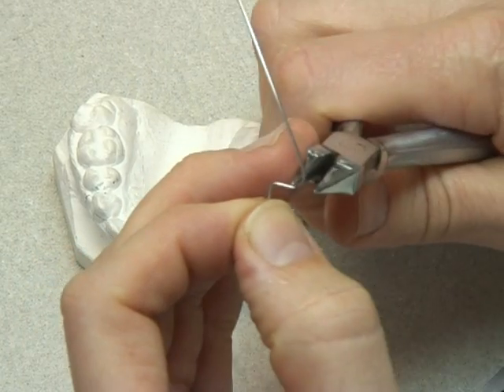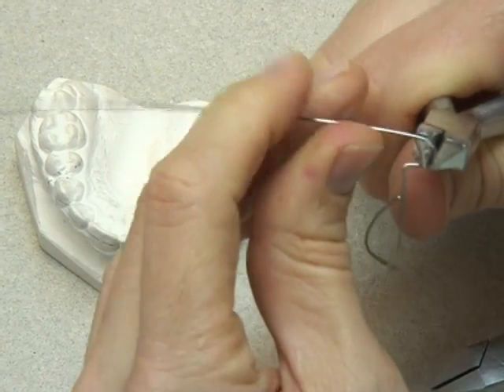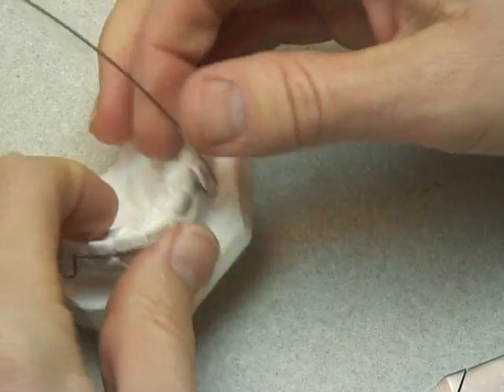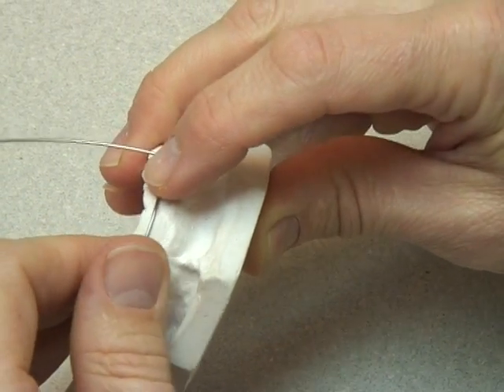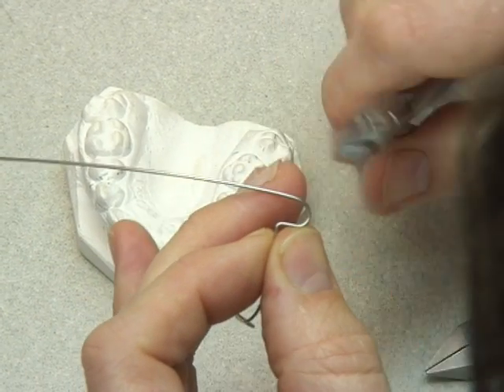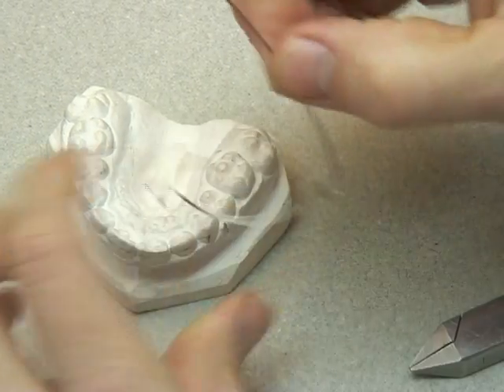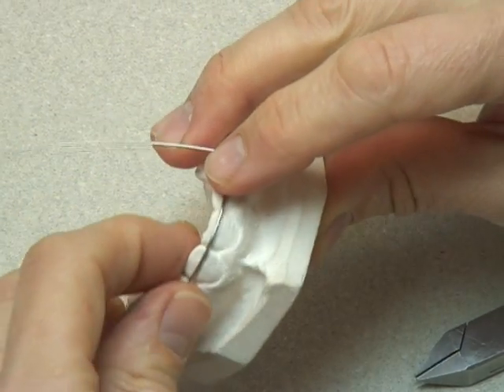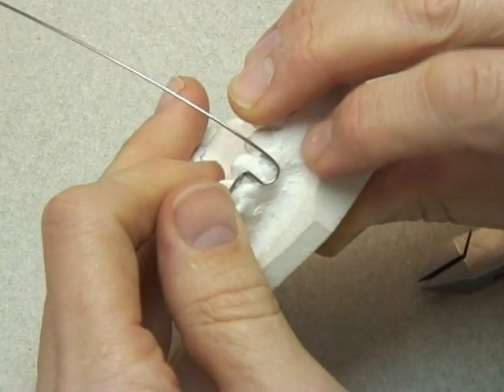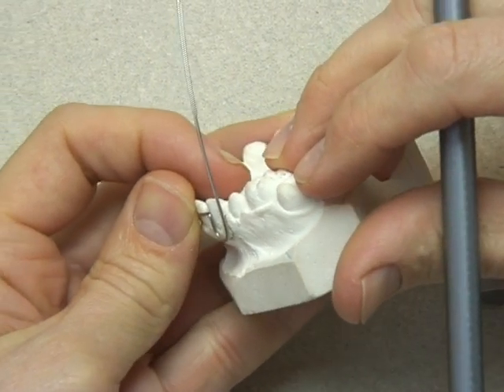I've drawn all my labial bow on to this model, and it's always a good idea to draw it on — certainly when you're training — so that you've got something to follow. Whenever you take the wire off, always ensure you fit it back on to the model in the same place, otherwise you can't be sure that you're making the bend in the exact place that you need to. If you're ever in any doubt about the fit, just go back a stage, undo a bend, and check that everything is in position.